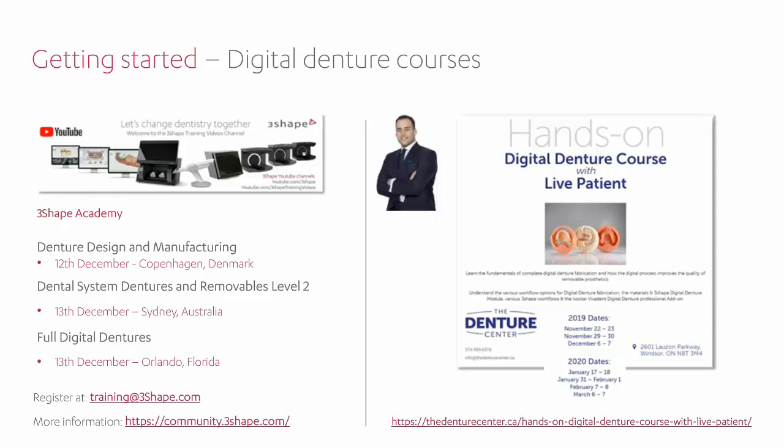Also, Erik Kukucha, who is a really great denturist in Windsor, Ontario, Canada, has some great courses. He hosted courses recently and it was great feedback. Here you will learn both the scanning part and the whole design part, so this is a full-blown clinic and lab workflow.